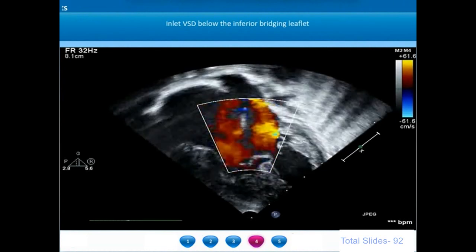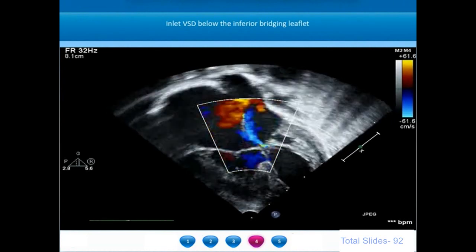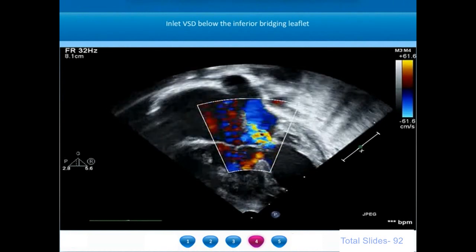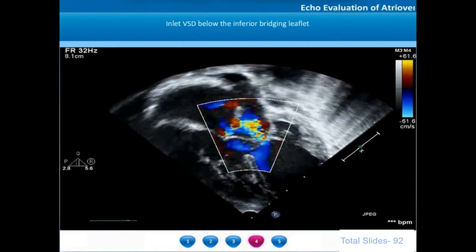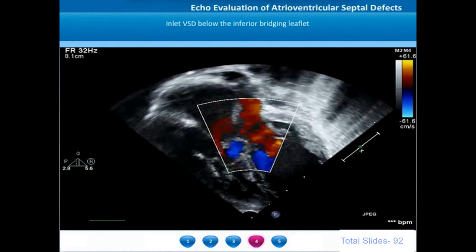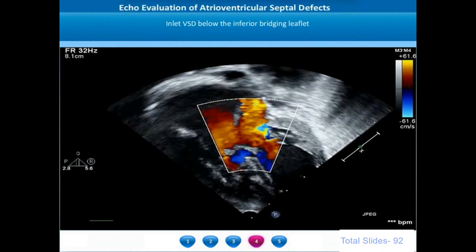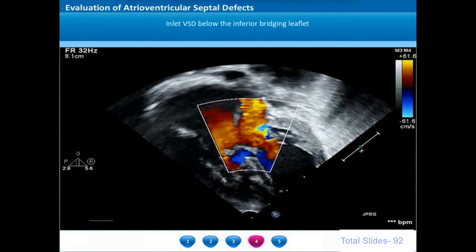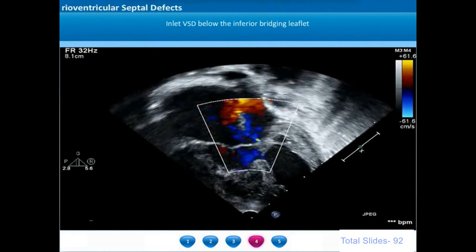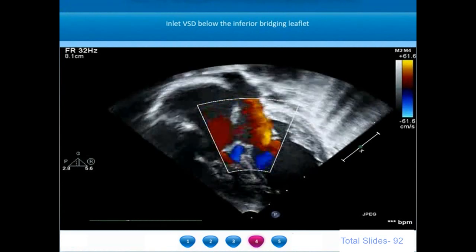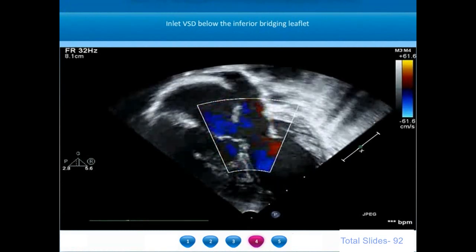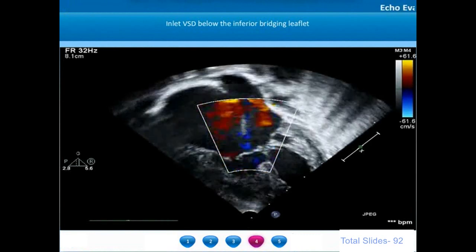We can appreciate a large inlet ventricular septal defect located beneath the inferior bridging leaflet. There is bidirectional color flow through that inlet VSD. We can also notice a moderate AV valve regurgitation seen on the left-sided component towards the left atrium. The ventricular function is good.